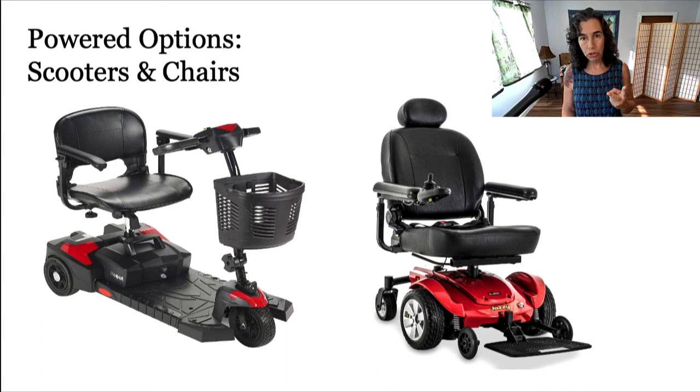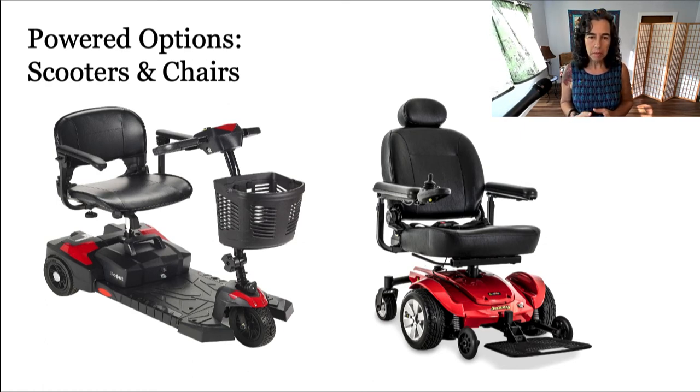There's actually two different options, so I called it powered wheelchairs, but there are scooters, as you can see on the left, and chairs that you can see on the right. A little anecdote and also note about our language. We typically use powered options rather than electric options because we don't want to be talking about electric chairs.